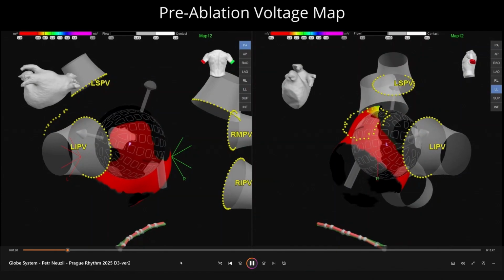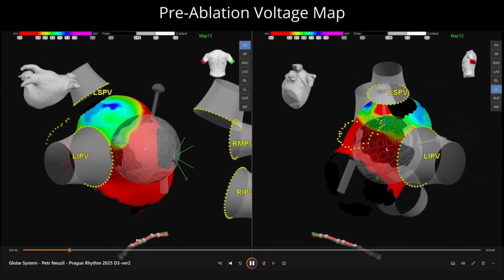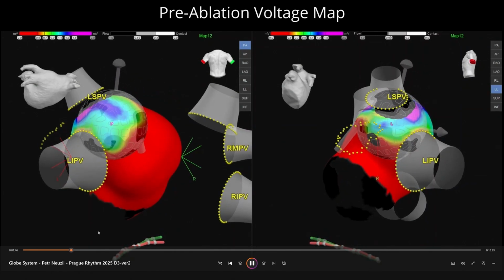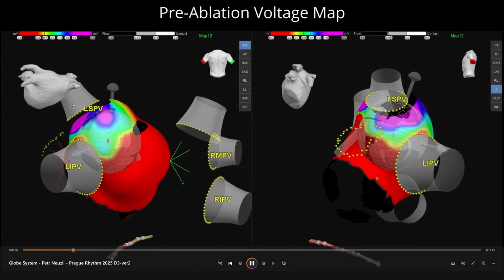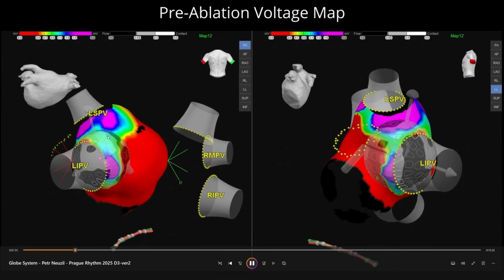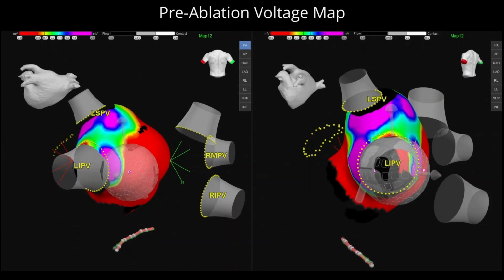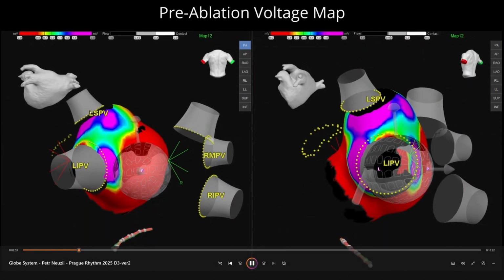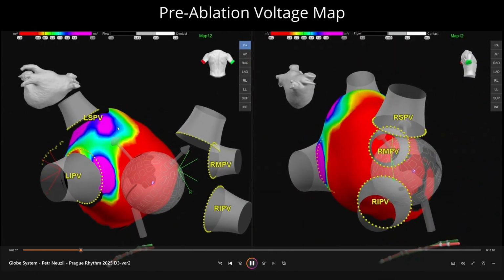As I stressed during the presentation, whenever you open this 30 millimeter basket, whatever globe catheter inside the body, you can immediately get some information: highly valuable voltage information, and other information like activation. What is very important is to indicate briefly where the orifices of the veins are to build up the body.